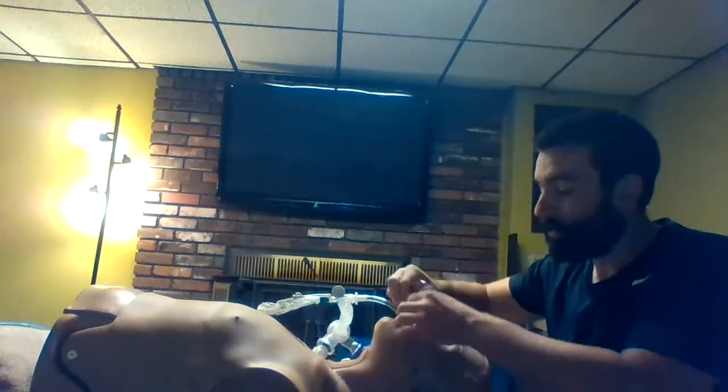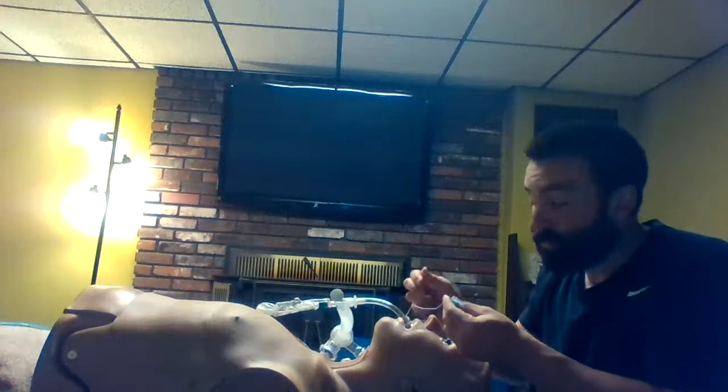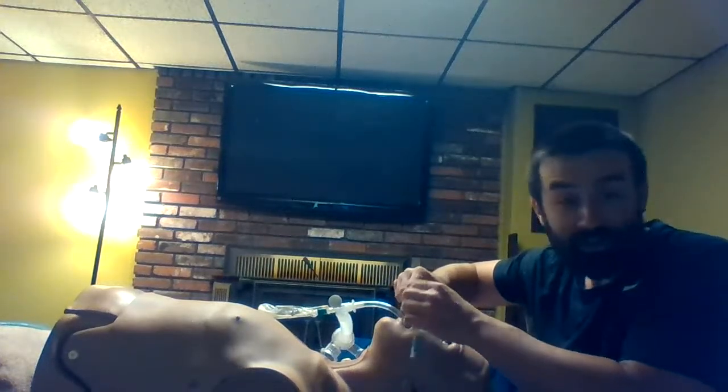So if you think you got a little bit of a micro tear or something like that in the pilot balloon, all right, in the spot right around the mouth, we can take a pair of scissors, we can snip this, and then this piece actually slides right back down in the pilot balloon. And now I left my scissors out of view here. Otherwise, I would snip this thing and kind of show you. All right. So with that being said, you want to be careful about snipping this, and you need to be ready to put it in.